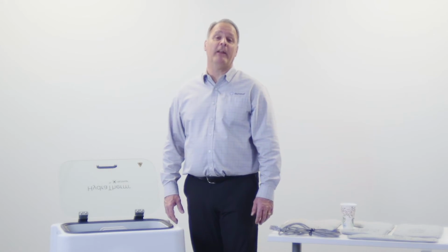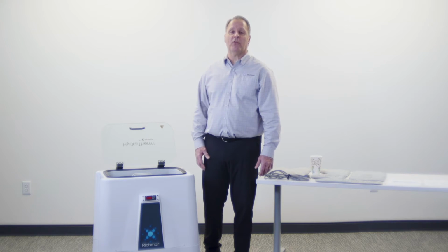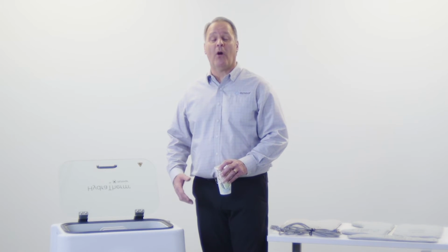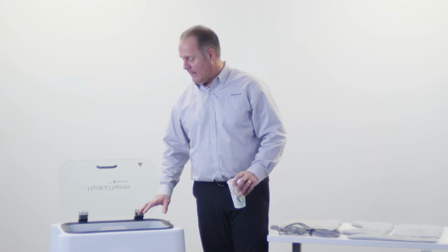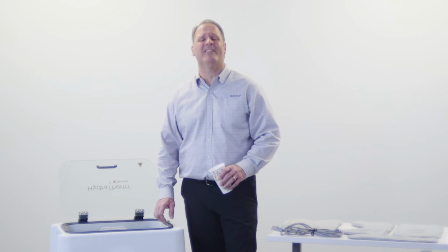You may have noticed in your quick start guide, or if you happen to read the manual, that we recommend the use of distilled water. There are numerous reasons why we recommend distilled water. Number one, city water does have fluoride in it, which acts similar to chlorine, which will deter or lower the life of your packs in your unit. But also, most water has some type of contaminants, be it iron, calcium, and all that. You may have noticed that buildup on your older hot pack units, and on stainless steel devices, you'll see the white powdery residue. We just feel that if we eliminate all that, your device will last longer and you won't have to clean it as often. The one thing we forget from basic chemistry class back in junior high is that one property of distilled water is it does not conduct electricity.